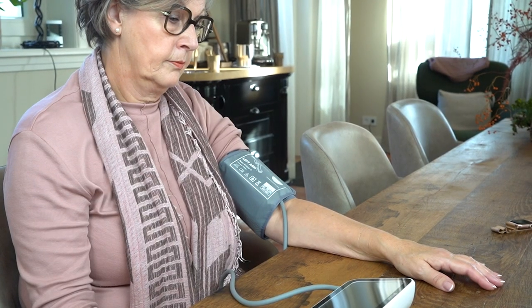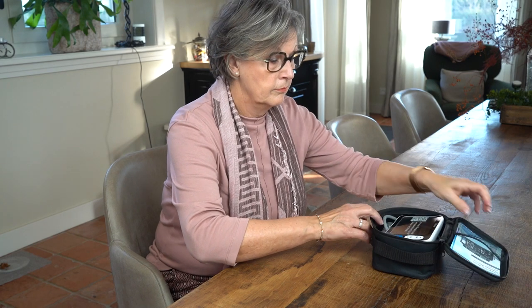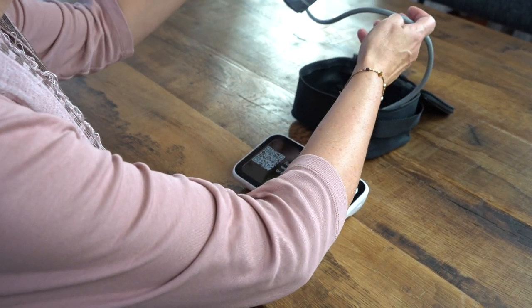When you want to measure your blood pressure at home, accuracy is vital. In this video, we are going to help you prevent the most common mistakes when taking a measurement.